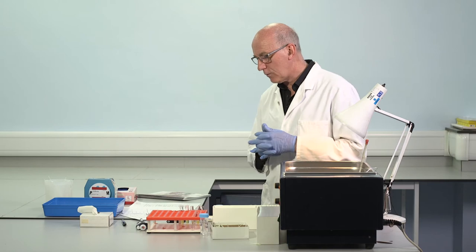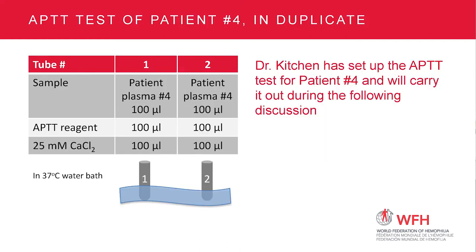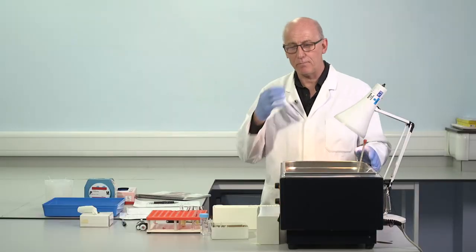So, on the patients we've done so far, sample 1, 47.5, mild prolongation. Second sample, 113, 116, pretty gross prolongation. Third sample, 75, 76. So also an important prolongation. So we've got also a couple more test samples. Okay. So we'll start the next one running. So we've got some prolonged results. What do we do?